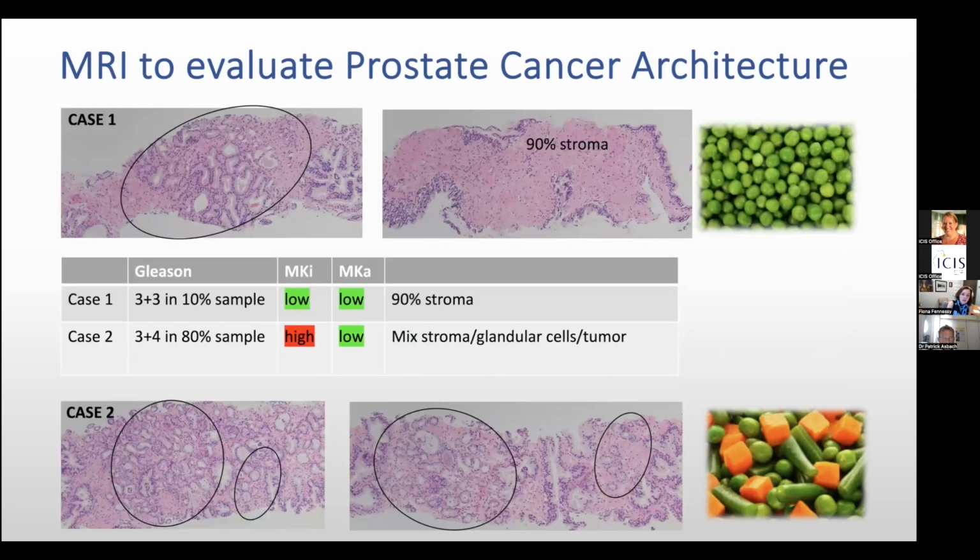And so there has been some initial work in this. Based on these microdiffusion metrics, you can actually predict what the stroma is and what the amount of cellular tissue or stromal or glandular tissue will be. Not only can you predict what it will be, but you can potentially figure out the extent, with these maps, of how far out these changes in the cellular architecture are, and then that can help direct where the borders actually are of the tumor.